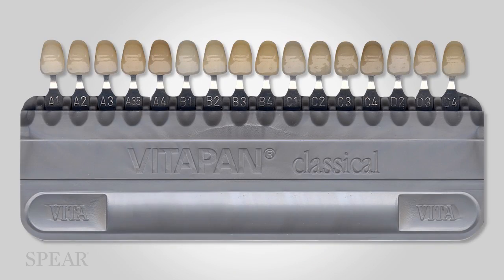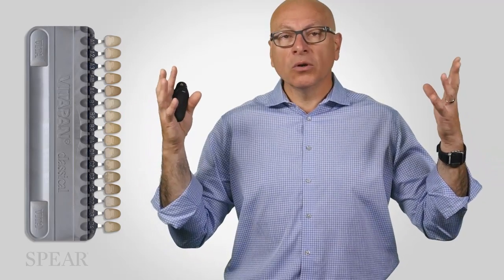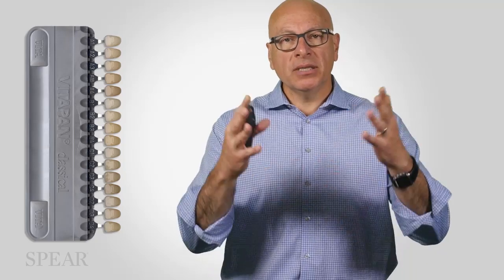Every dental company will tell you that they really match the Vita Pan shade guide. And that's what we know as dentists. In dental school, we have always been told the Vita Pan, Vita Pan Classic. If you are my age or older, you definitely know this. Nowadays, maybe there's a little introduction of different shade guides like the 3D from Vita, but this is kind of the standard. And dental companies manufacturing resin composites are trying to match the Vita Pan shade guide.